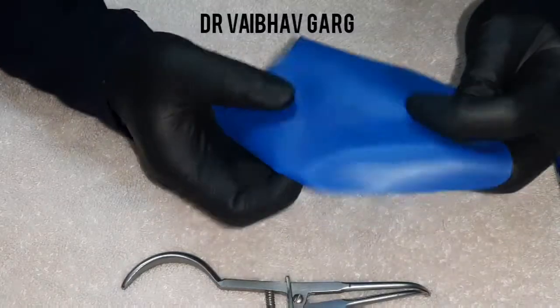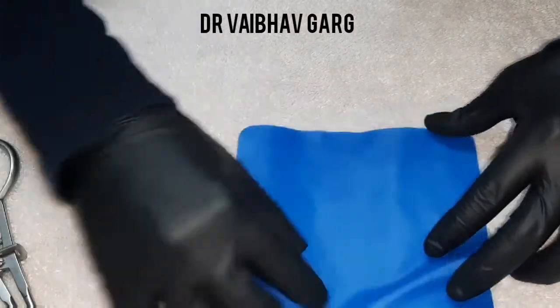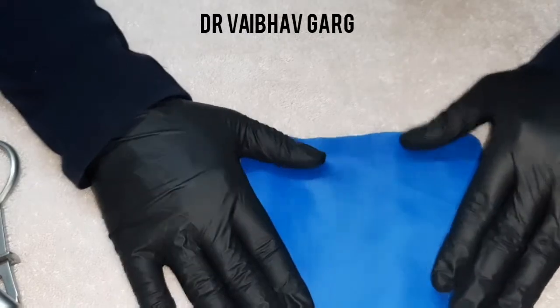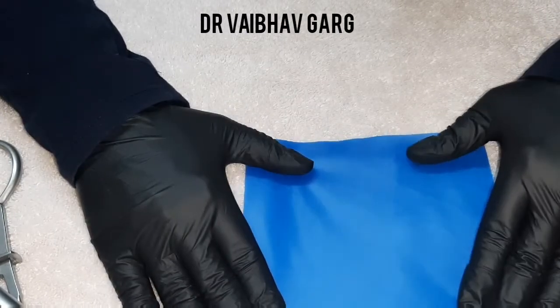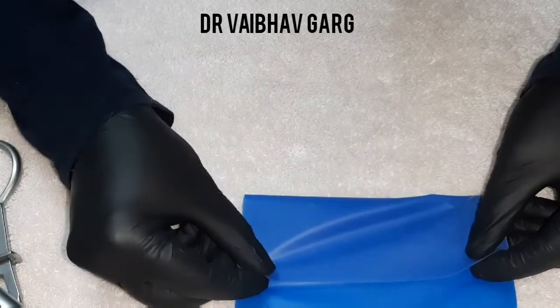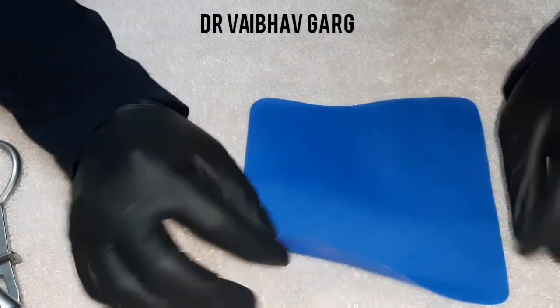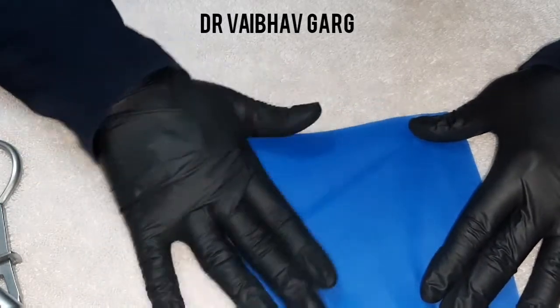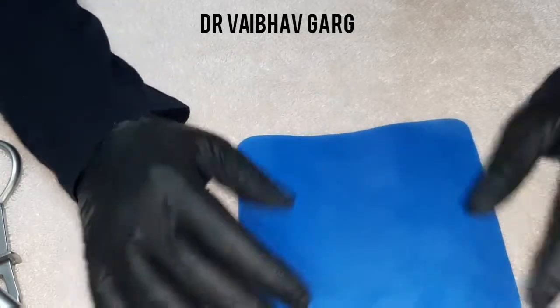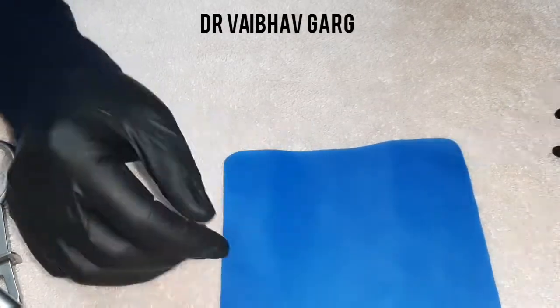This is how a rubber dam sheet looks. In most kits this is a deep blue color. Multiple colors have been introduced — purple, red, pink, yellow, black, and mint green. There are two surfaces: one is more reflective and one is less reflective, with a dull or matte finish. Every sheet has a matte finish on one side and the other side is shiny or reflective.